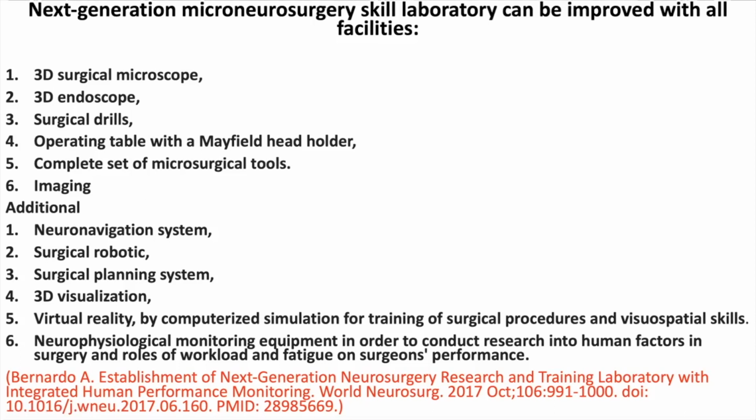It should have a 3D surgical microscope and 3D endoscope, surgical drills, operating table with Mayfield head holder, complete set of microsurgical tools, the imaging facilities, and additionally one can have neuronavigation, surgical robots, surgical planning systems, 3D visualization, virtual reality by computerized simulation for training of surgical procedures and visuospatial skills, and neurophysiological monitoring equipment in order to conduct research into human factors in surgery, and the role of workload and fatigue on surgeons' performance can be judged.